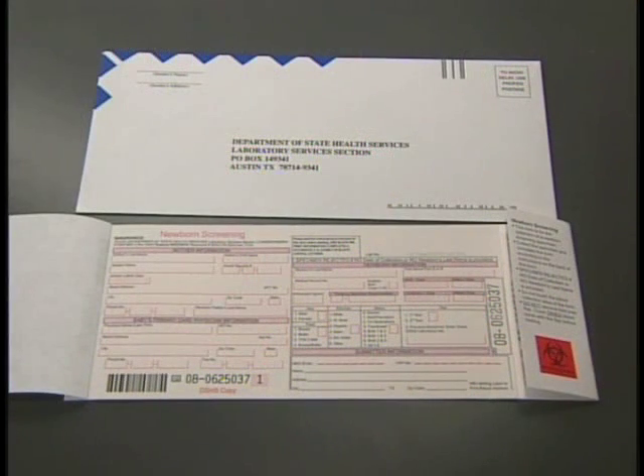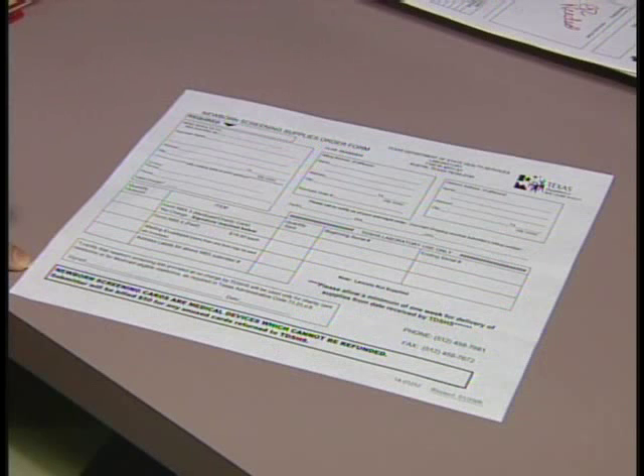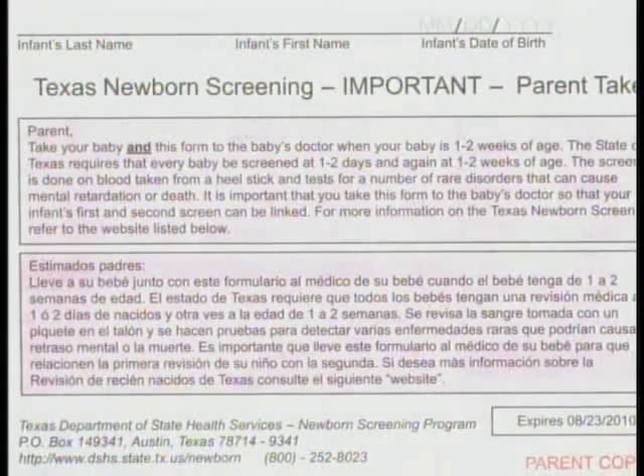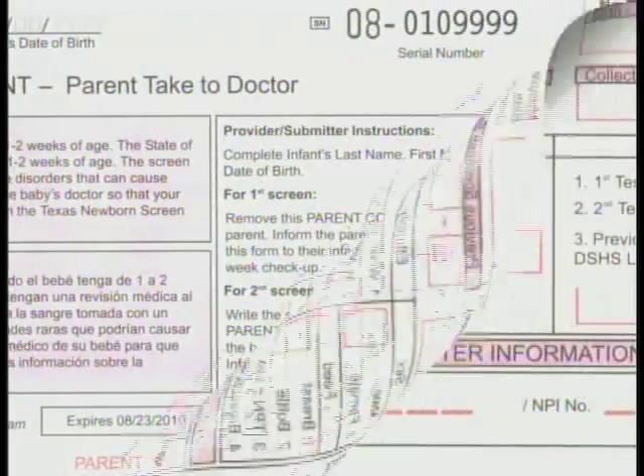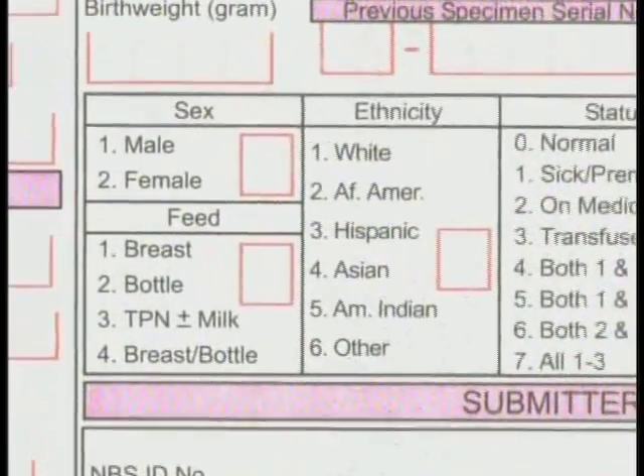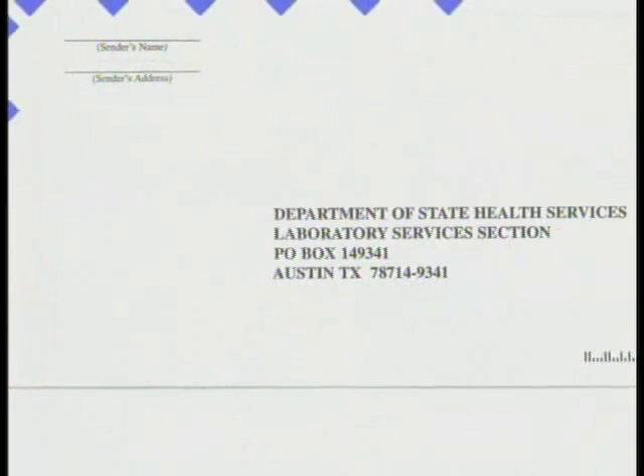The newborn screening sample must be collected using specific supplies that must be ordered from the Texas Department of State Health Services Laboratory. Use the DSHS newborn screening supplies order form to make your orders. The collection kit contains a specialized filter paper collection form that includes an area for recording patient demographic information and a special mailing envelope. The filter paper has five circles onto which the blood specimen will be applied.